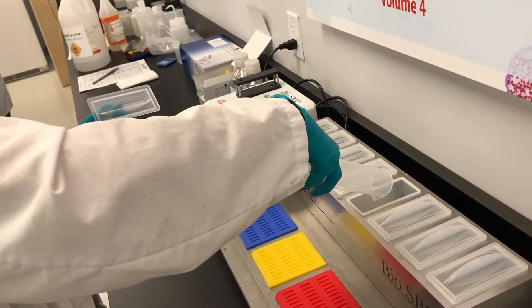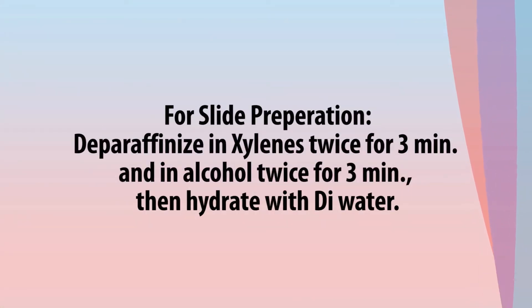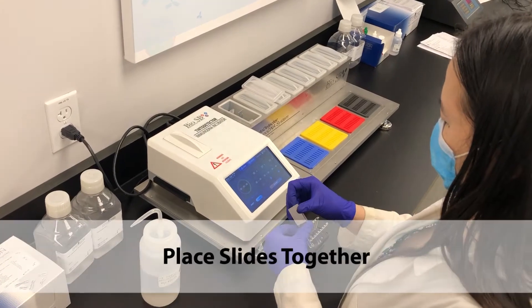For slide preparation, you need to deparaffinize in xylene twice for 3 minutes and alcohol twice for 3 minutes, then rehydrate with DI water. The slides here have already been prepared.